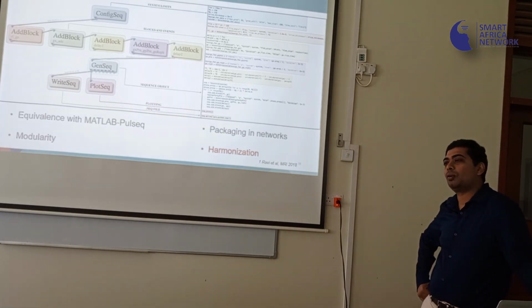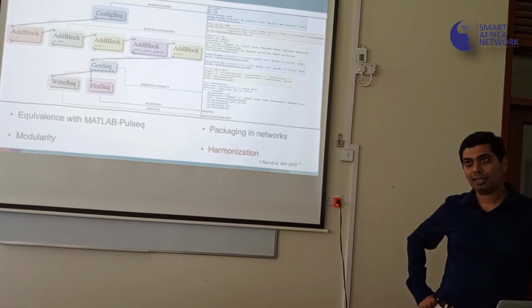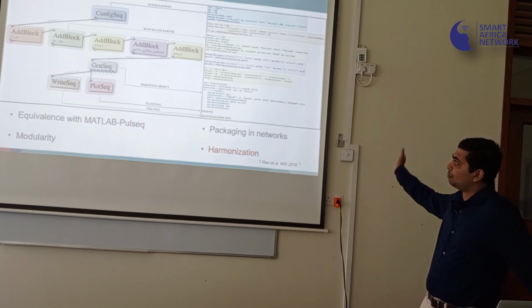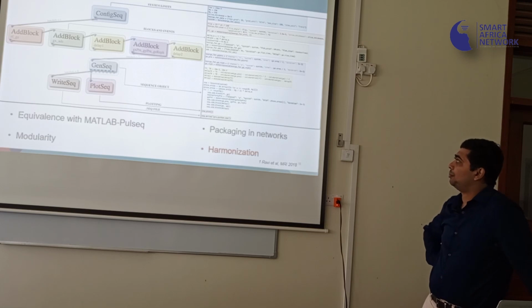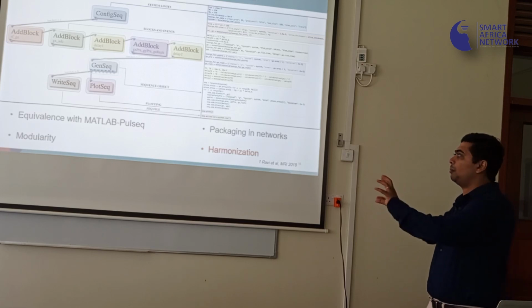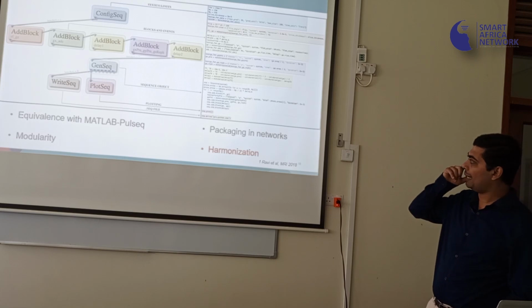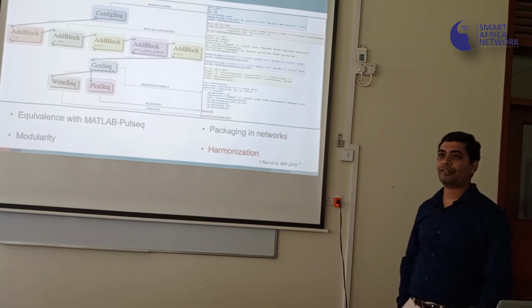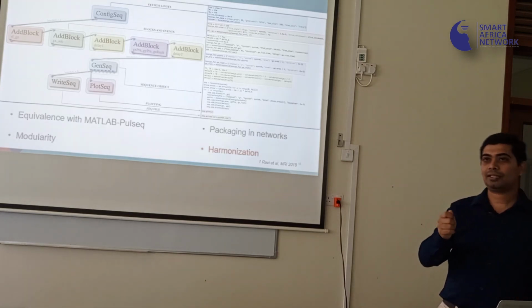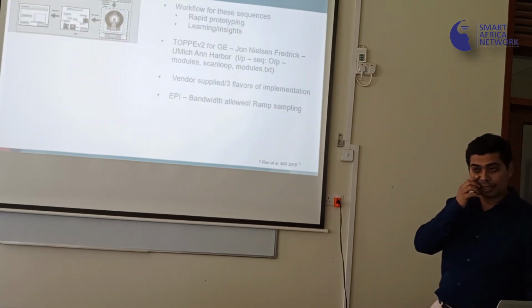What you do here, again on the right, I don't think it's legible, but on the right is the Python code equivalent for those blocks. So if somebody was more interested in scripting, you could use the one on the right. On the left, you basically pull these blocks and concatenate them like Legos, one next to the other, and then the last one where you see write sequence actually gives you a file that you can take, plug into the scanner, and play. So we went about doing that.